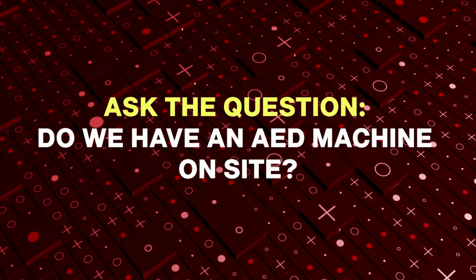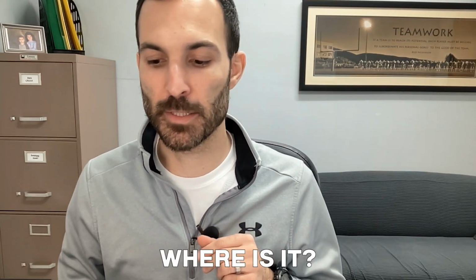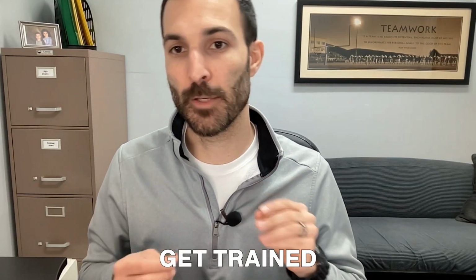My recommendation is a couple things. Number one, especially in the workplace, ask the question, do we have an AED machine on site? Oftentimes 50% of people in the workforce don't even know if they have one. Number two you want to ask is, where is it? How do we locate it? How quickly can I get to it? Can I access it?